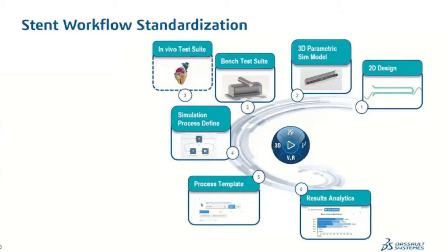Well, in this particular case, since this workflow is well understood and mature, we can go ahead and standardize a series of steps that are needed to be conducted, as shown here. We can, for instance, specify exactly how the 2D design should be developed, and then how the 3D simulation model should be constructed from it. We can specify exactly what tests should be conducted and how the test scenario should be defined, using either the standard set of bench tests, or as we've seen, more advanced in vivo tests using the Living Heart model. Then we construct the specific sequence of computational modeling that is needed, including multi-physics simulations if appropriate.